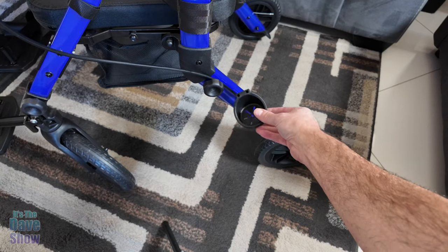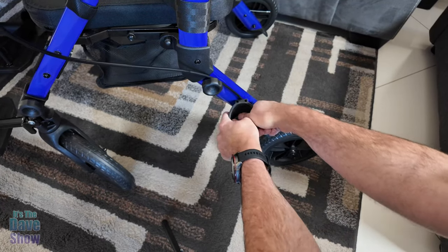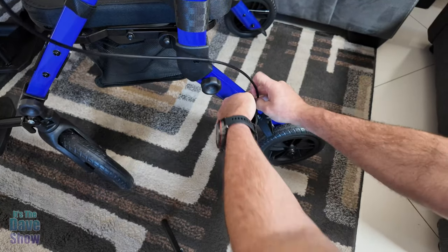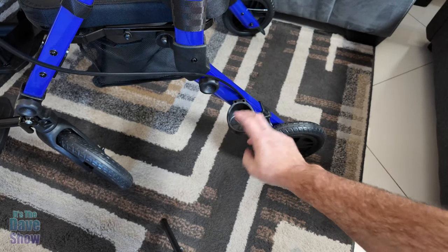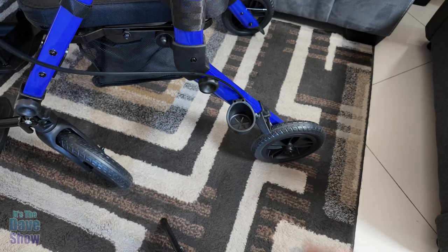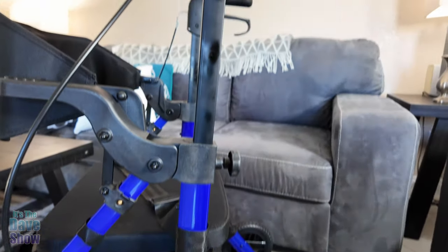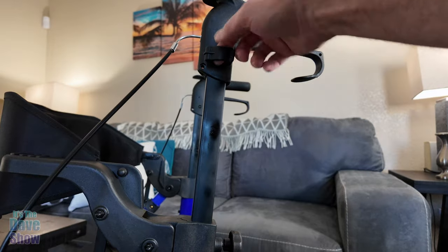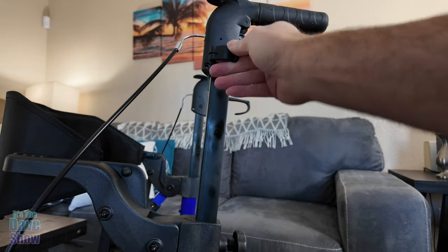There's only one more piece — a little cup-like cane holder. It just slips right onto this little button. You move the cable out of the way and snap it in. Now if you have a cane, you hold it here at the bottom, and there's also a little attachment up top that the cane can slot into as well, so you have a full place to hold a cane.